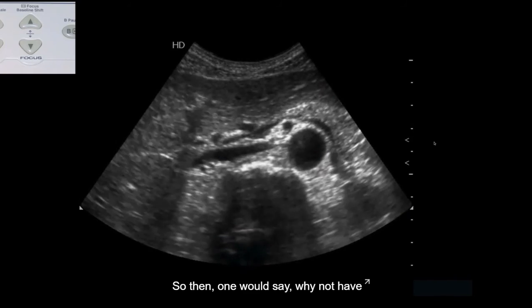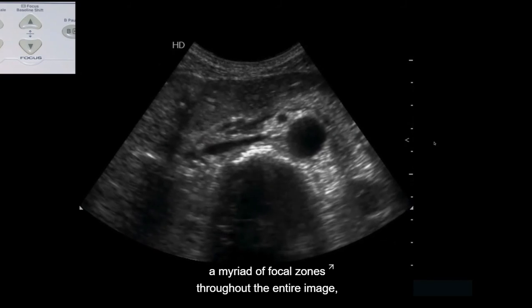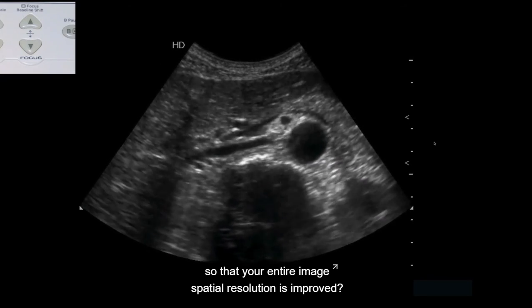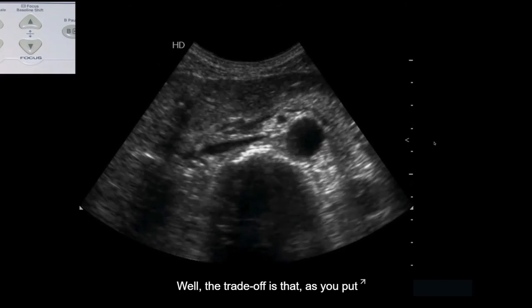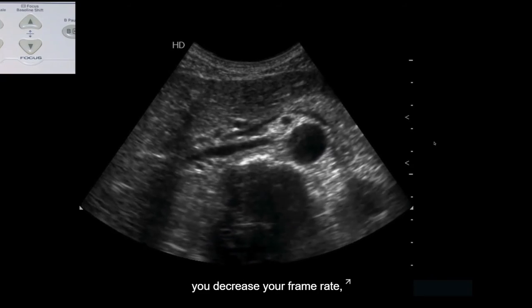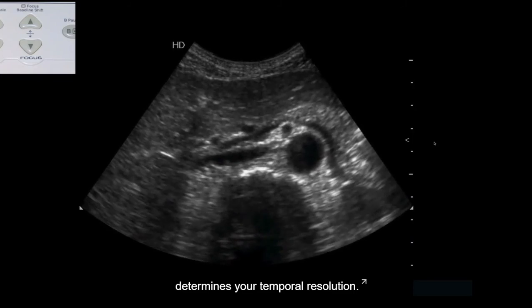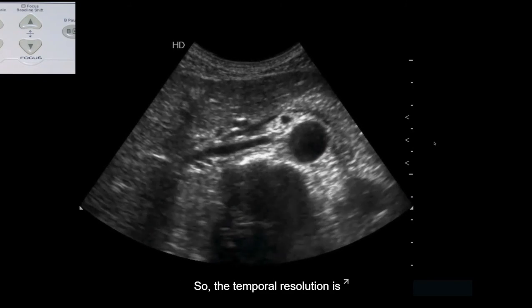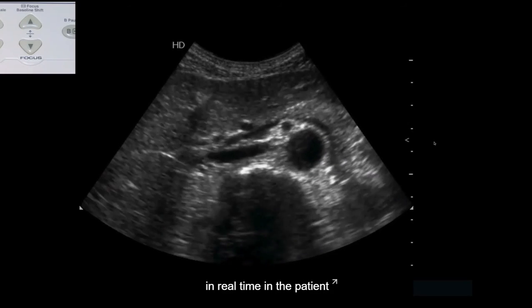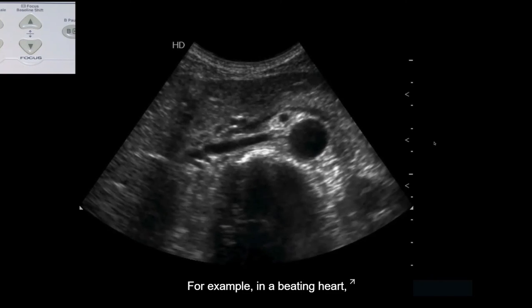So then one would say, why not have a myriad of focal zones throughout the entire image so that your entire image spatial resolution is improved? Well, the trade-off is that as you put more focal zones on the machine, you decrease your frame rate. And your frame rate is one of the things that determines your temporal resolution. So the temporal resolution is how accurately what's happening in real time in the patient is being displayed on the ultrasound image. For example, in a beating heart.